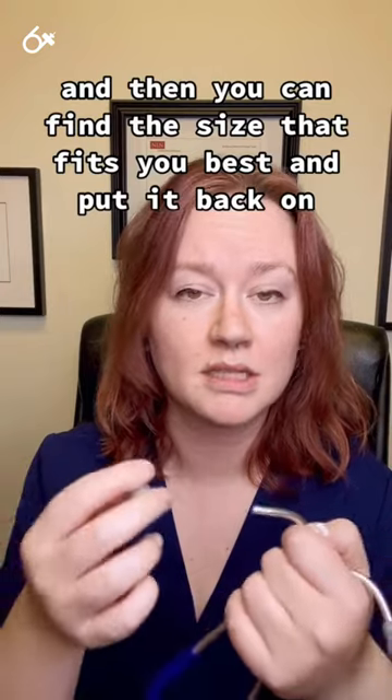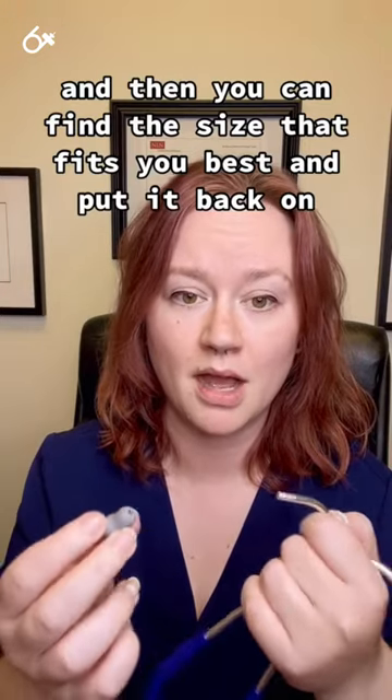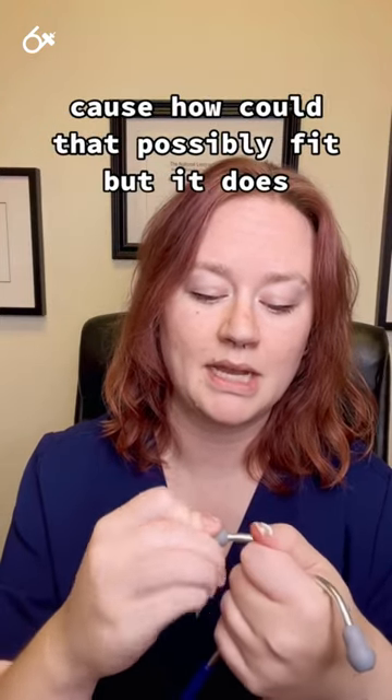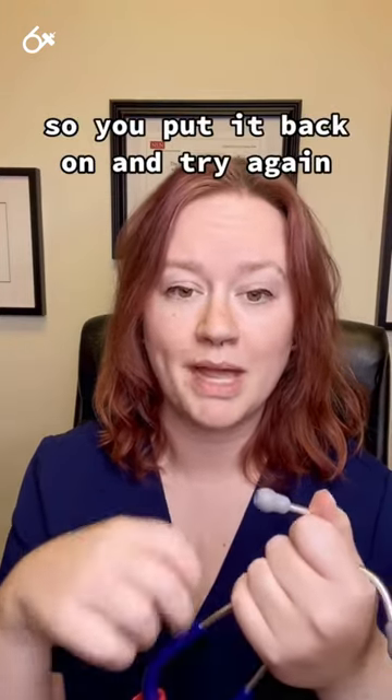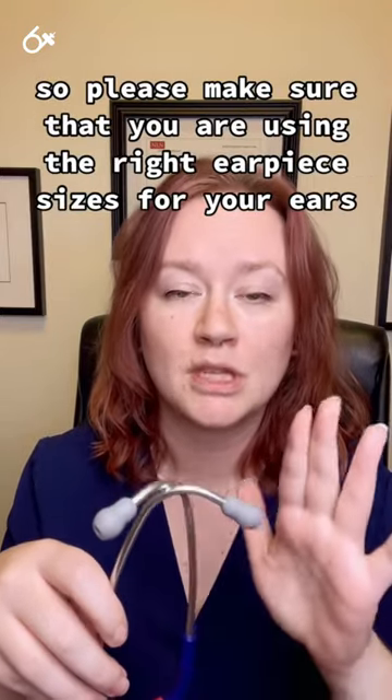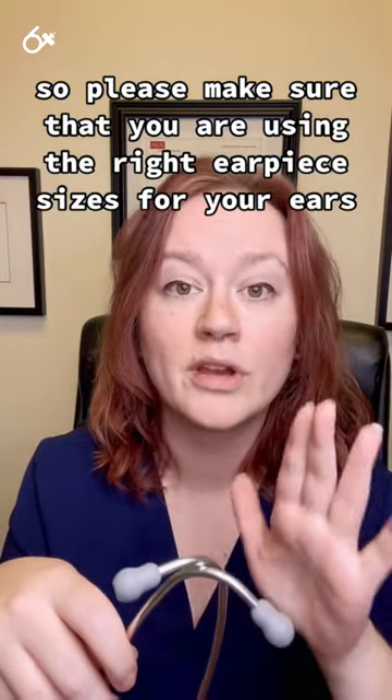Then you can find the size that fits you best and put it back on. Sometimes it seems like it's not going to go back on — but it does. So put it back on and try again. Please make sure that you are using the right earpiece sizes for your ears.